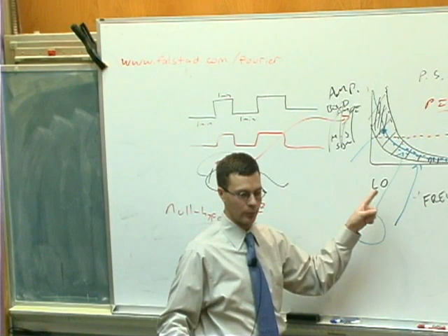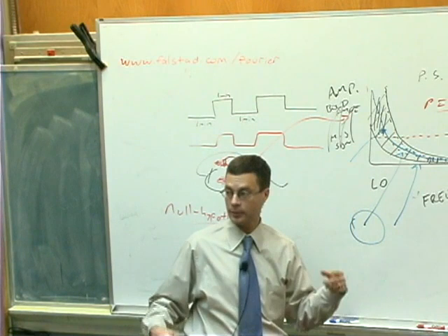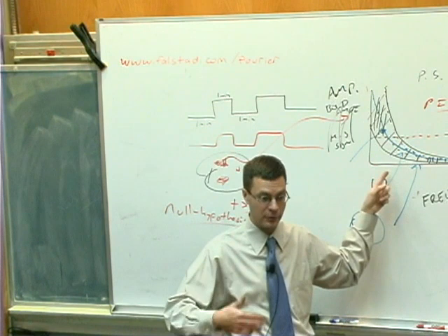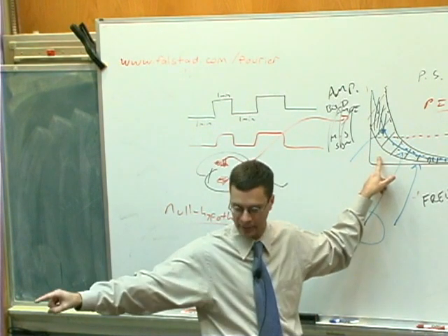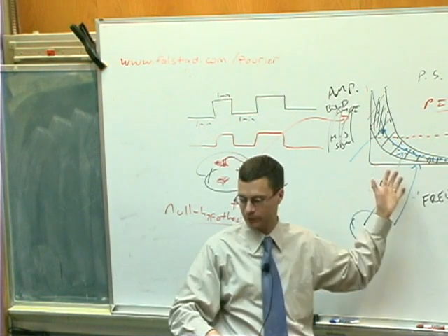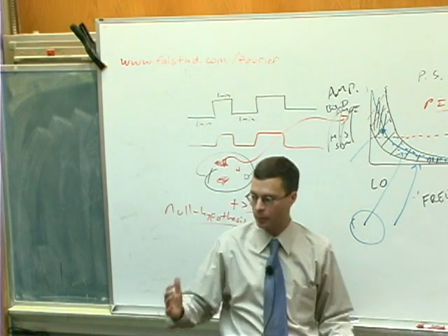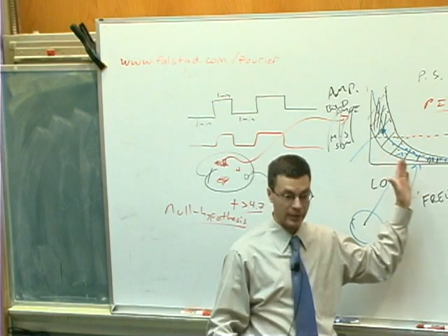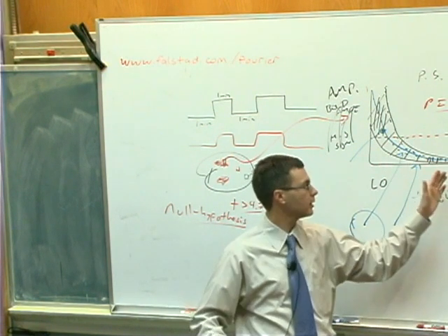A second consequence of the 1 over f noise is that it renders certain sorts of experimental designs less powerful than others. Namely, experimental designs that look for slow changes in neuronal activity are going to be rather tough to do, because it's going to be hard to distinguish a slow change in neuronal activity that you introduce with your experiment from all the slow changes in BOLD fMRI signal that were there just as a consequence of noise. It's hard to distinguish experimentally induced slow changes in neuronal activity from noise. So that would suggest that if you want to design a pretty good BOLD fMRI experiment, you should aim for fairly high frequencies, right? The higher the frequency, the faster the repetition or on and off of neuronal activity, the better you're going to do from the standpoint of the 1 over f noise.